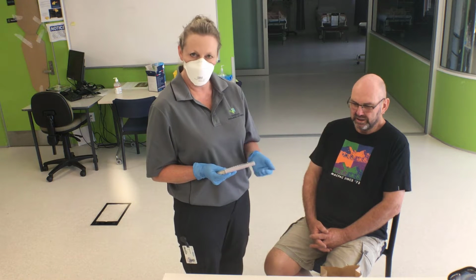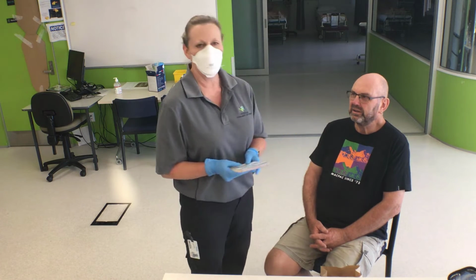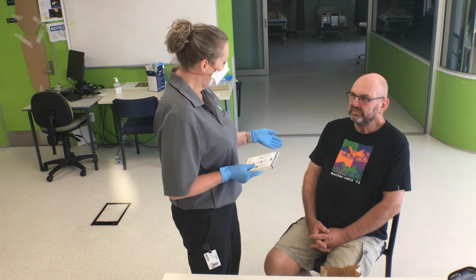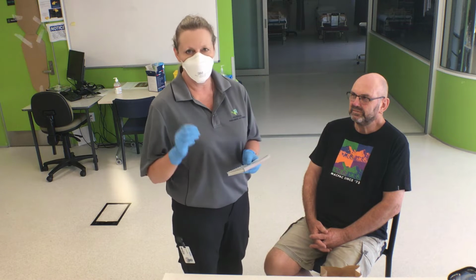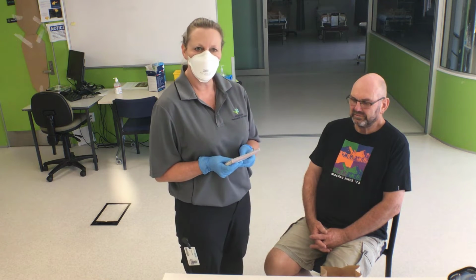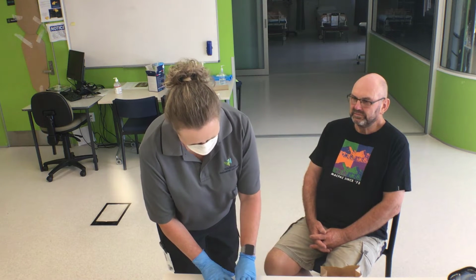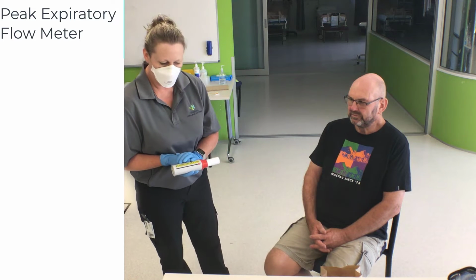and I'm going to use my paramedic decision making model, and I have decided that Don here is mild to moderate. So I would follow an action plan if Don had one available, but as he's explained to me, he hasn't got one yet. But Don does know his PEF or peak expiratory flow rate, so we're going to get him to do that. So this is a mild to moderate asthmatic.